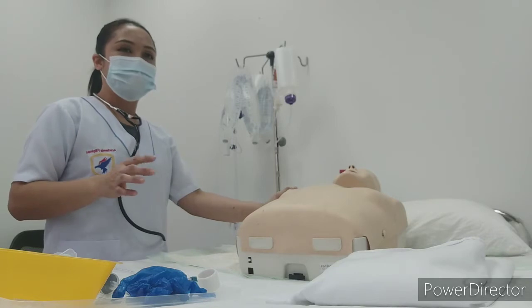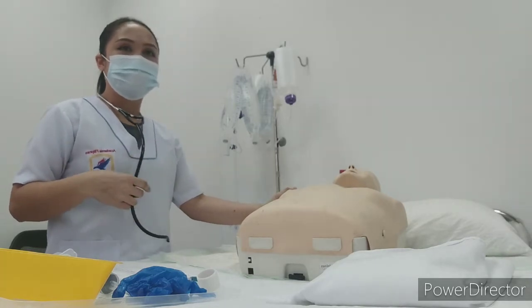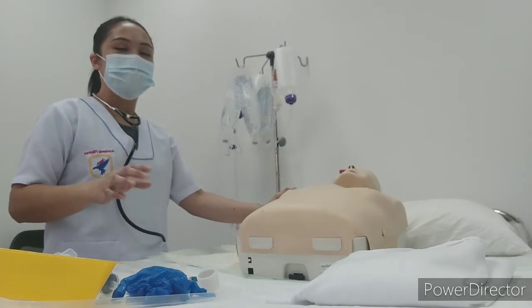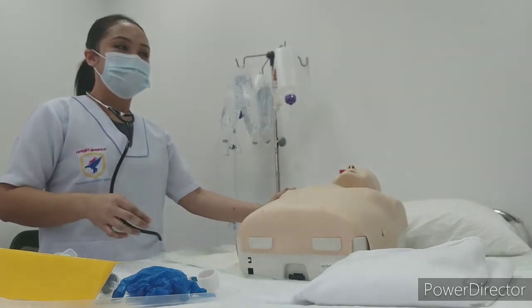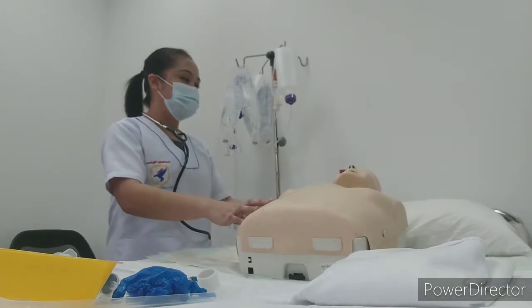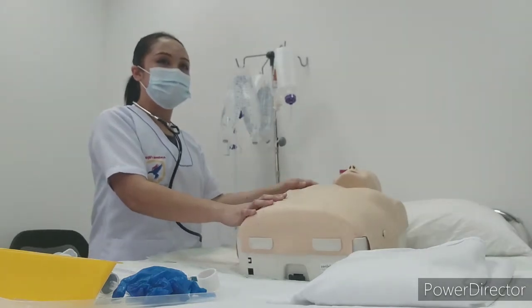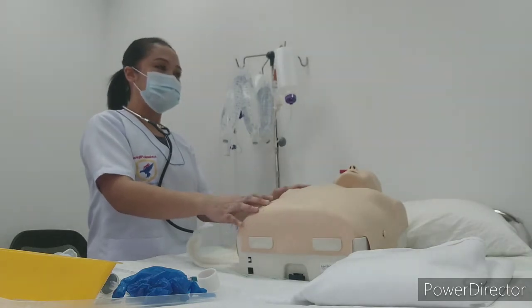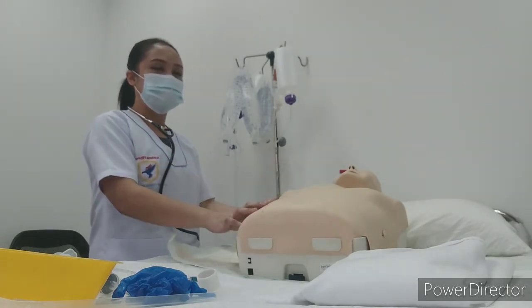And then CAPS. C is for collect, A is for arrange, P is for prepare, and S is for sanitize. So after that one, we need to secure also the safety of the patient. We need to lock the bed wheel and raise the bed bars for the security of the patient.